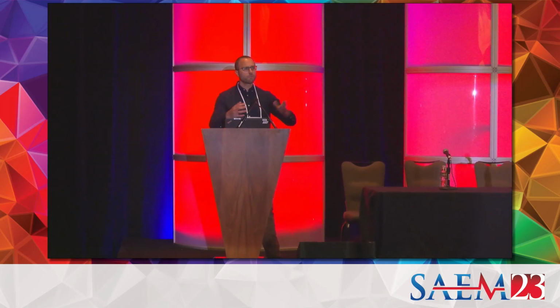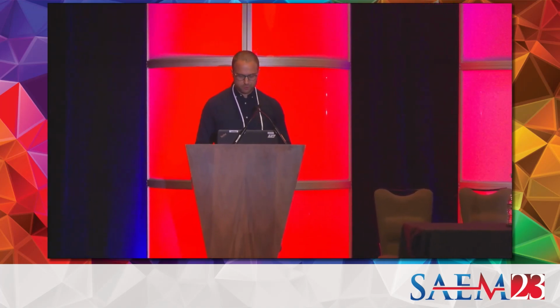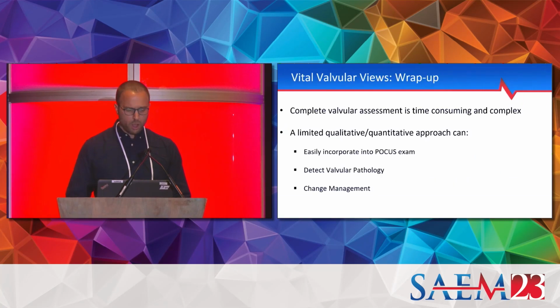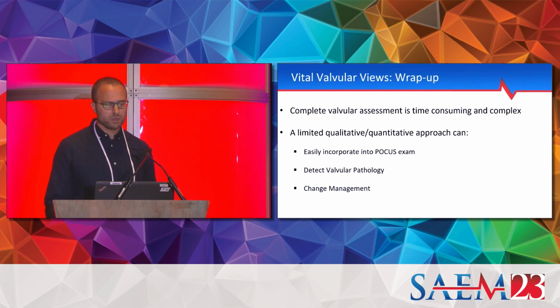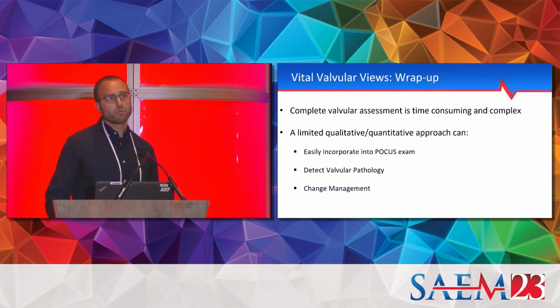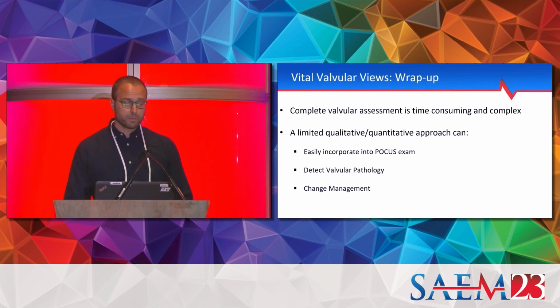All right, guys, we're going to wrap things up now. Hopefully you've had a chance to get your hands on the ultrasound a little bit and figure out how to access your Doppler modalities, learn a little bit about how you can apply this in your day-to-day management of patients in the emergency department. So hopefully the next time you have a patient coming in with shortness of breath, chest pain, hypoxia, new murmur, unexplained tachycardia, you're going to think about doing a POCUS exam. And I would strongly encourage you to think about incorporating Doppler into your exam.